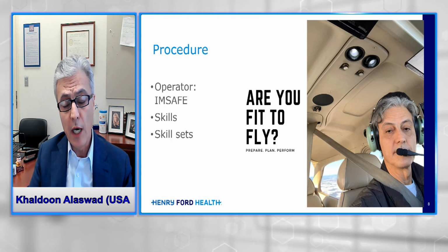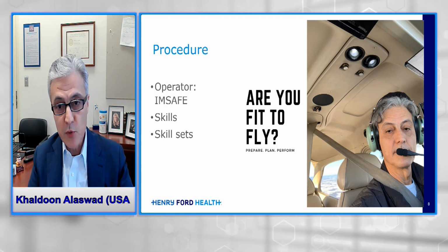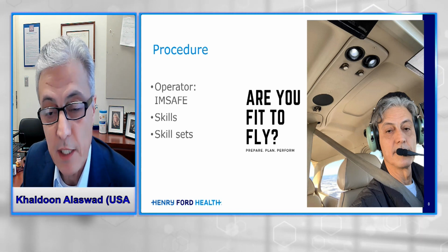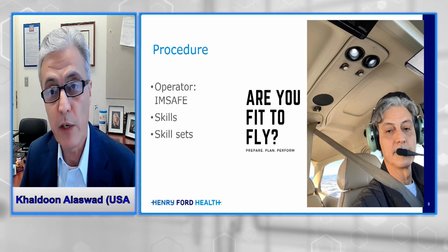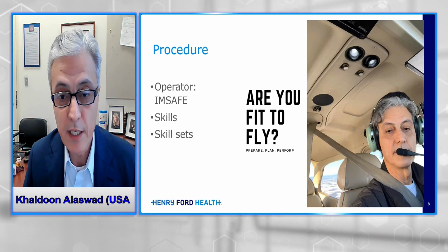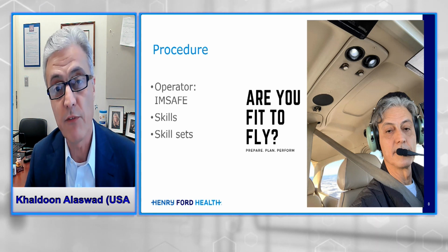So if you want to think about doing CTO PCI, there are multiple things you have to be prepared for. On the day of the procedure, you have to think about yourself as the pilot. I recently learned how to fly planes, and I learned that if you want to fly a plane, all your training is about safety. And in airplane preparation, there is something you have to check yourself as a pilot.